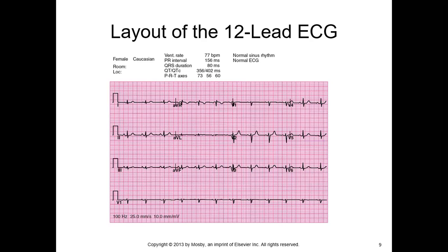When viewing the 12 lead, keep in mind that leads that line up vertically are simultaneous recordings of the same beat.